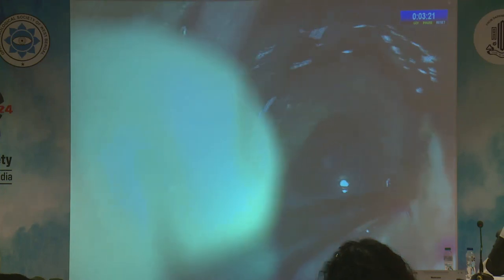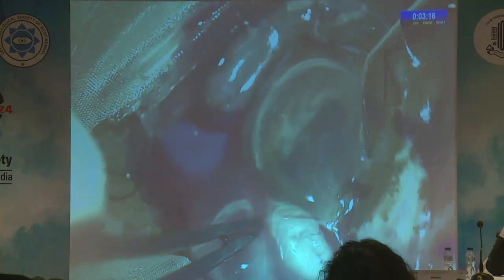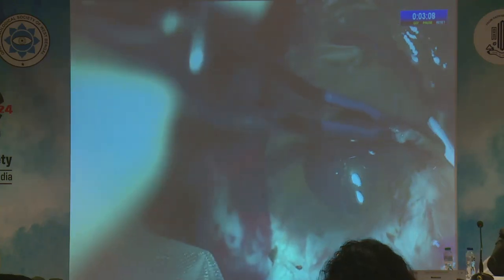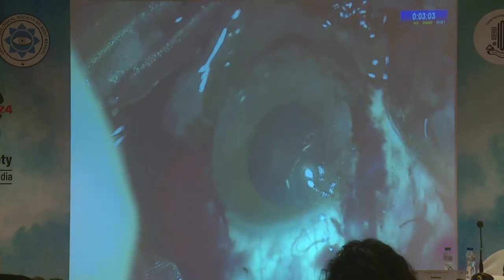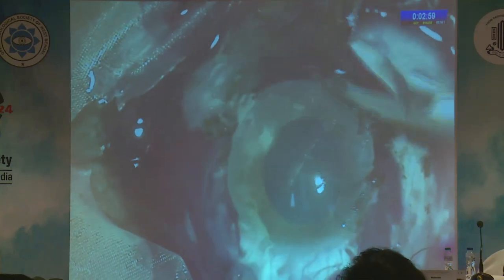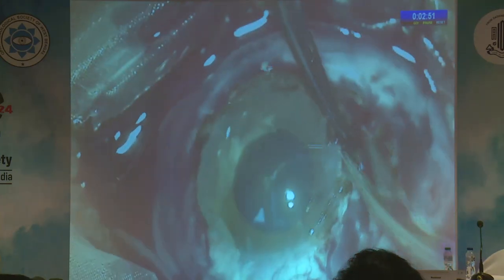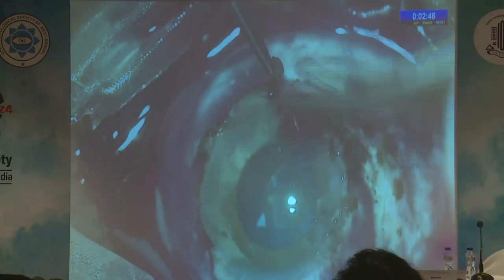Dissection was then shifted to the other end, but it was not coming out easily because of very deep involvement. A groove was made again in a separate plane and cut off by corneal scissors. Now, the free dissected conjunctiva was totally removed from its attachments at the limbus. The remaining limbal part of the nevus was gradually pinched off from the cornea by scissors.